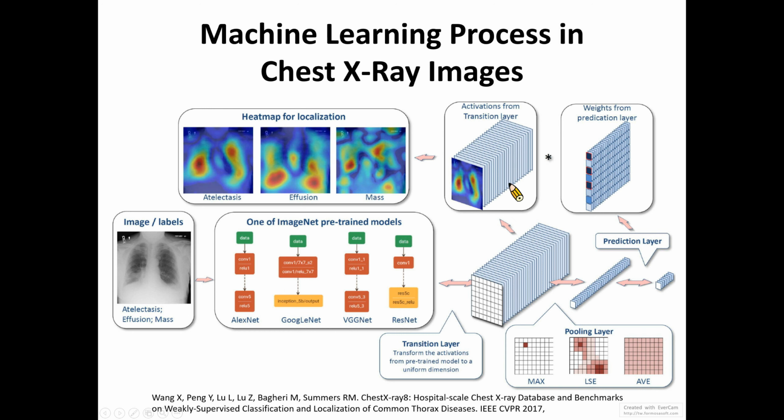You might be asking why we don't just change the parameters in the neural network. The simple answer is that this is a pre-trained neural network, so each weight in each layer is configured according to the input image data.